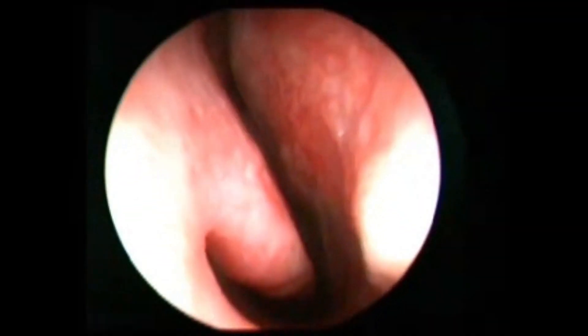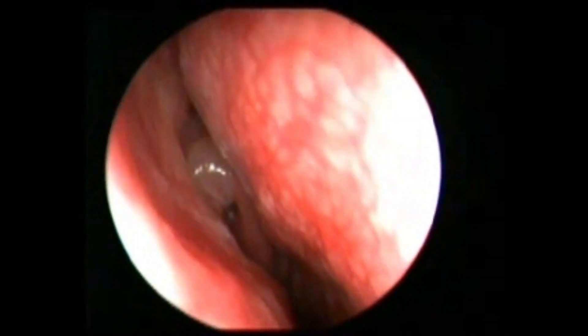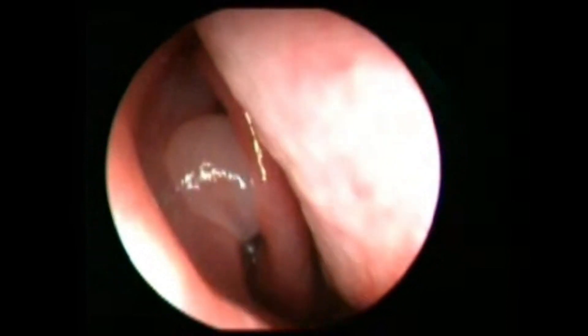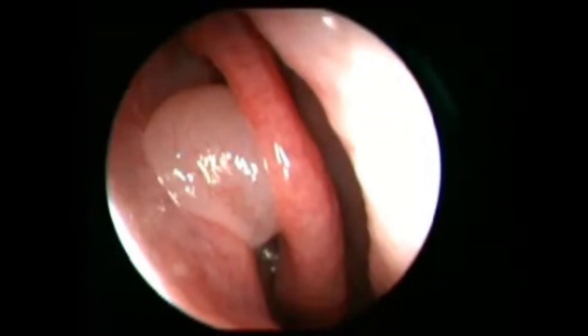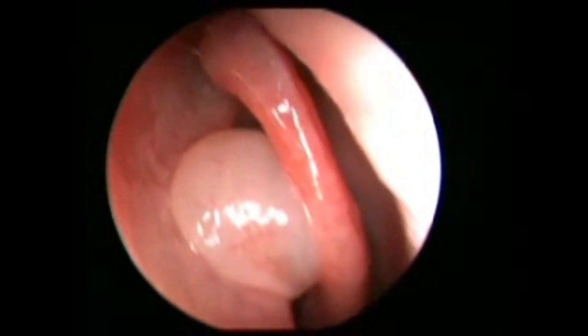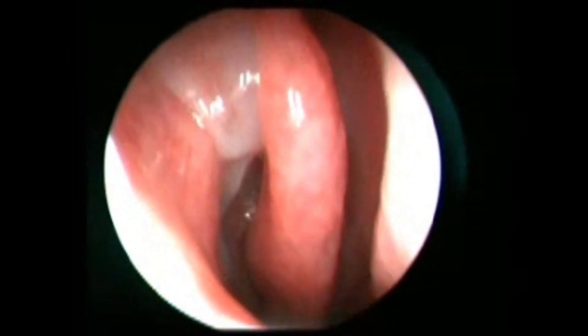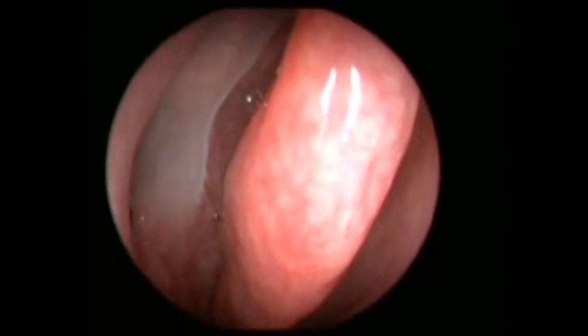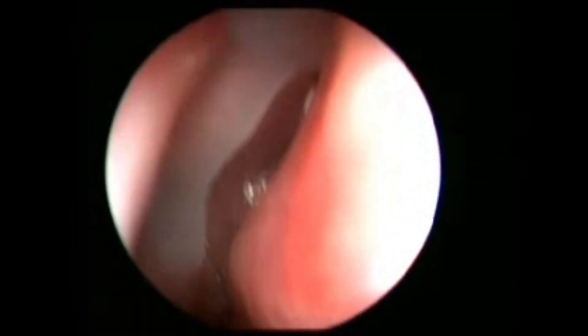Another case with a right septal deviation with a middle meatus polyp. As you can see, this polyp is single, unlike the ethmoidal one, and it is occupying a space in the middle meatus. Further going, we can see a stalk arising from a posterior fontanelle accessory ostium of the maxillary sinus, suggesting it was an antrochoanal polyp.